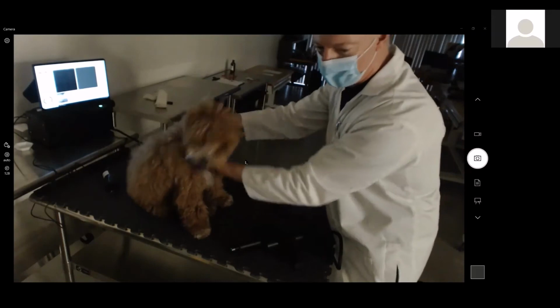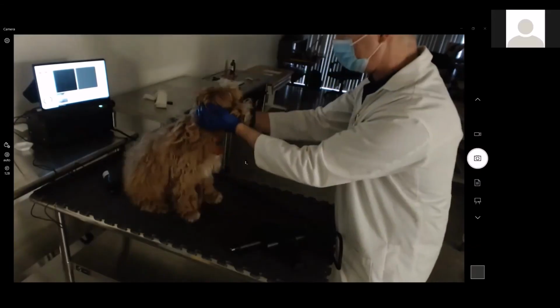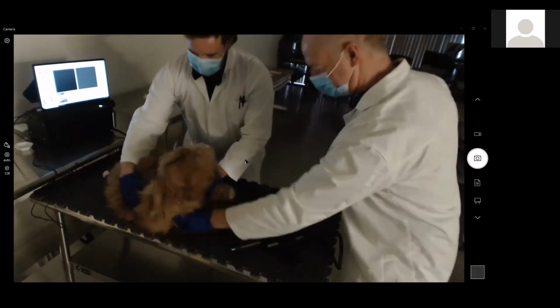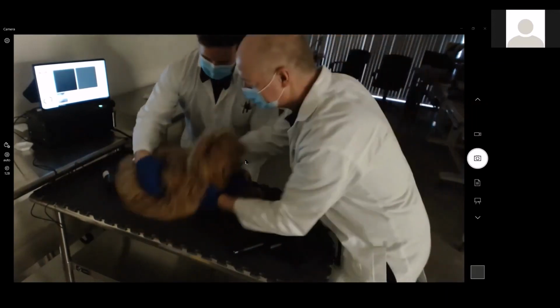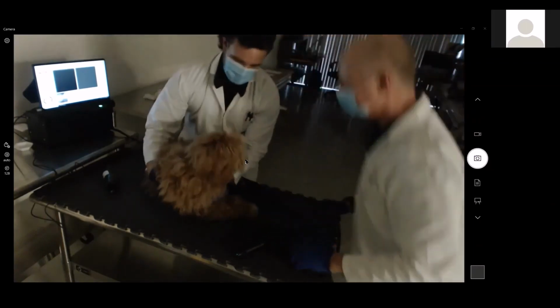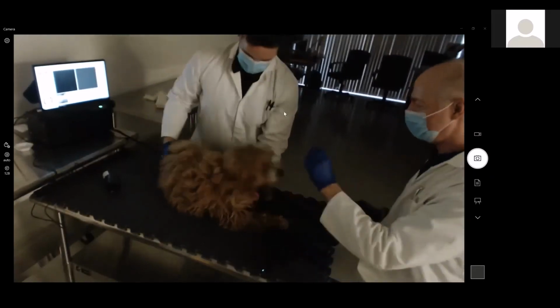Sorry, folks, we're doing a quick changeover again. We have to get some power going, as we're about to run out of battery power on one of the systems, so we're just powering that up real quick. Thanks, Bill. Are we good? All right, come here, Axon. Go ahead and let him sit up if you can. Here, bud, come on.